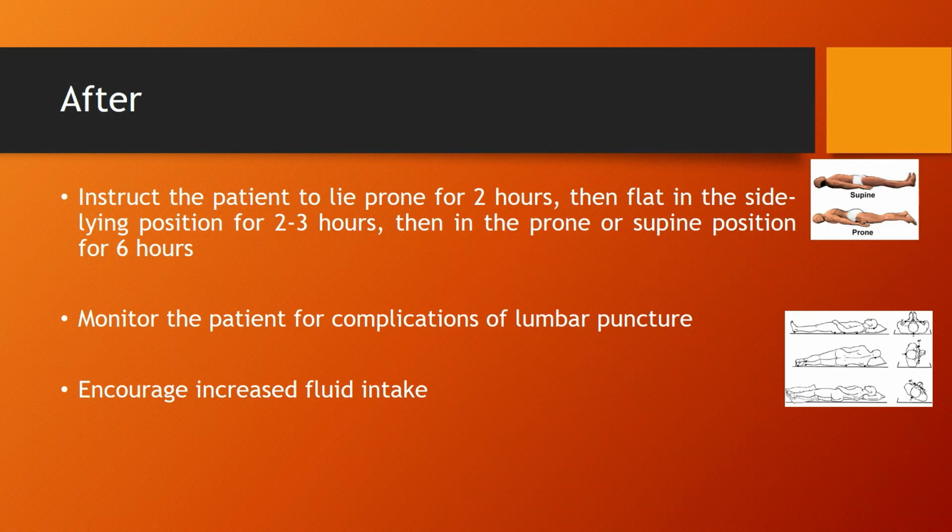This is to separate the alignment of the dural and arachnoid needle punctures in the meninges to reduce the leakage of CSF. And then, monitor the patient for complications of lumbar puncture. Notify the physician if complications occur. And then encourage increased fluid intake to reduce the risk of post-procedure headache.